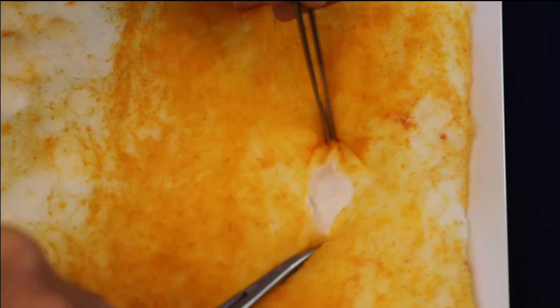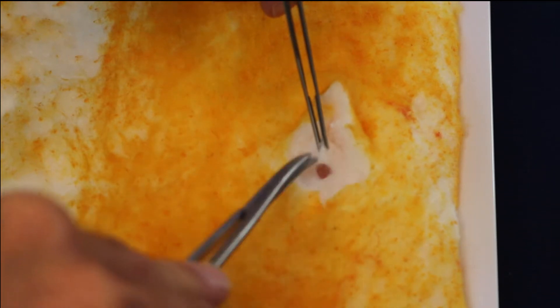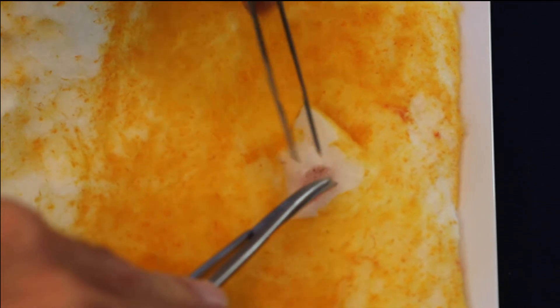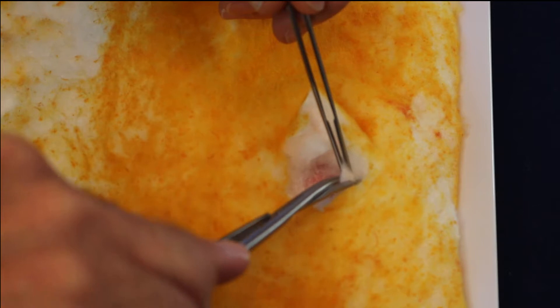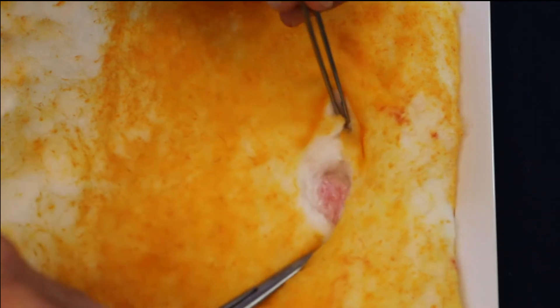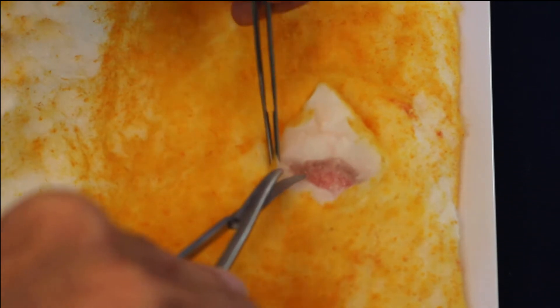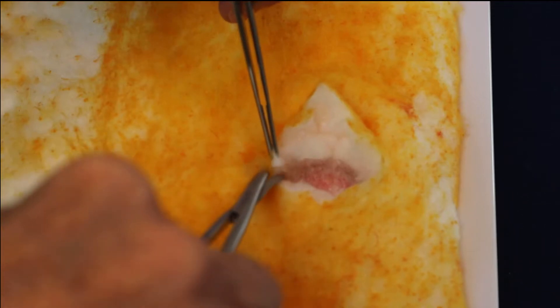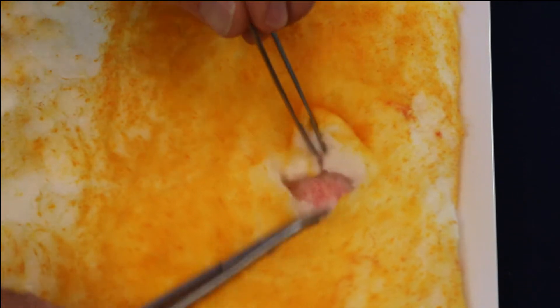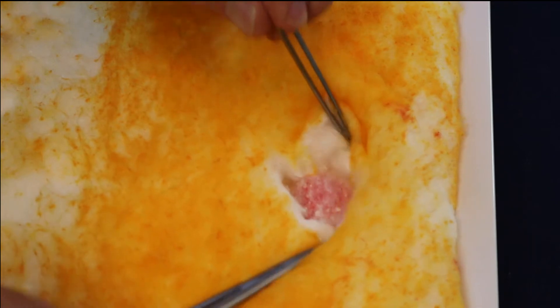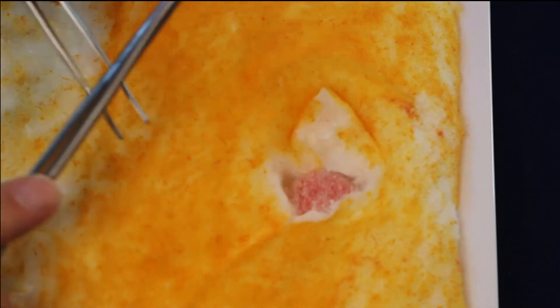This material is self-retracting and although you may have to push the material away occasionally, it should stay out of your way. With your scissors and forceps, dissect down along your initial incision until you encounter the mass. You will find that it is fairly adherent to the surrounding tissue, just like you might find with a lipoma or a sebaceous cyst.